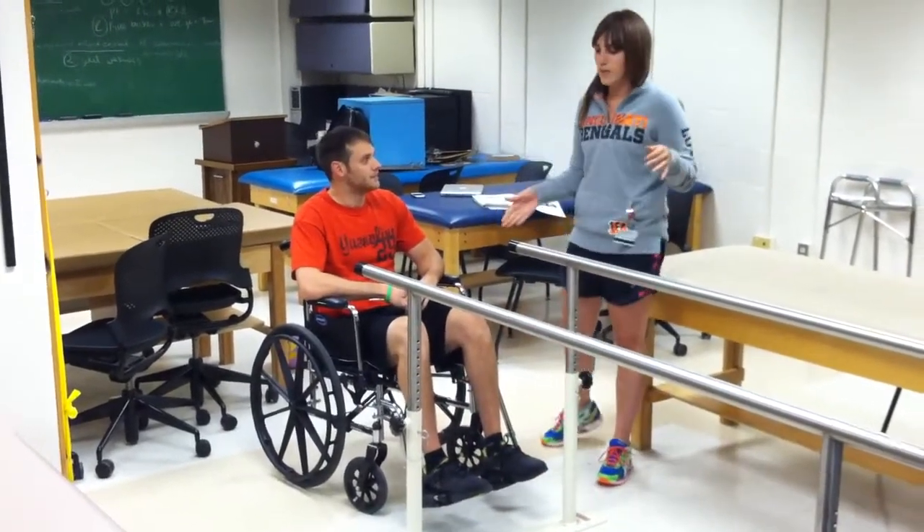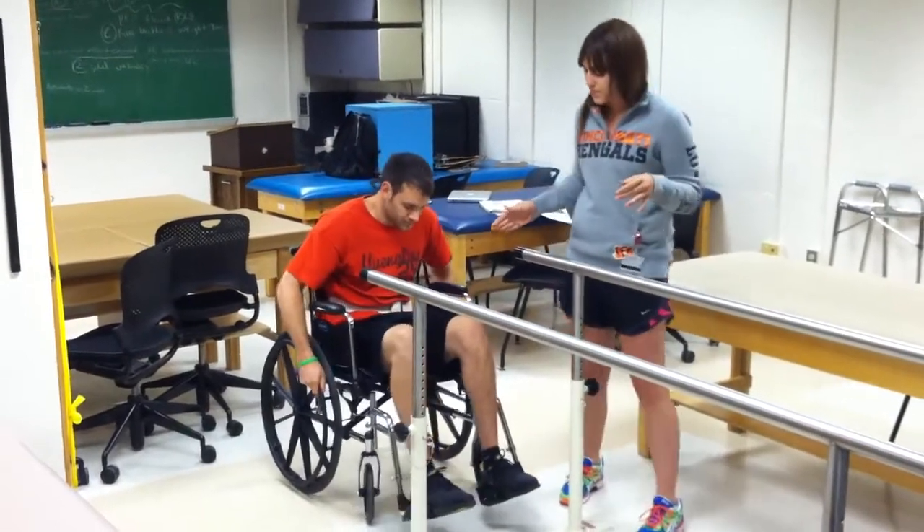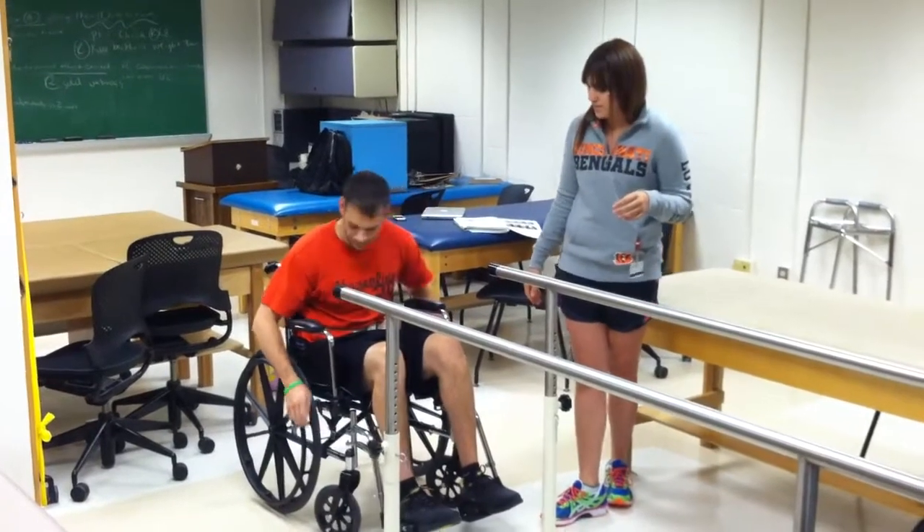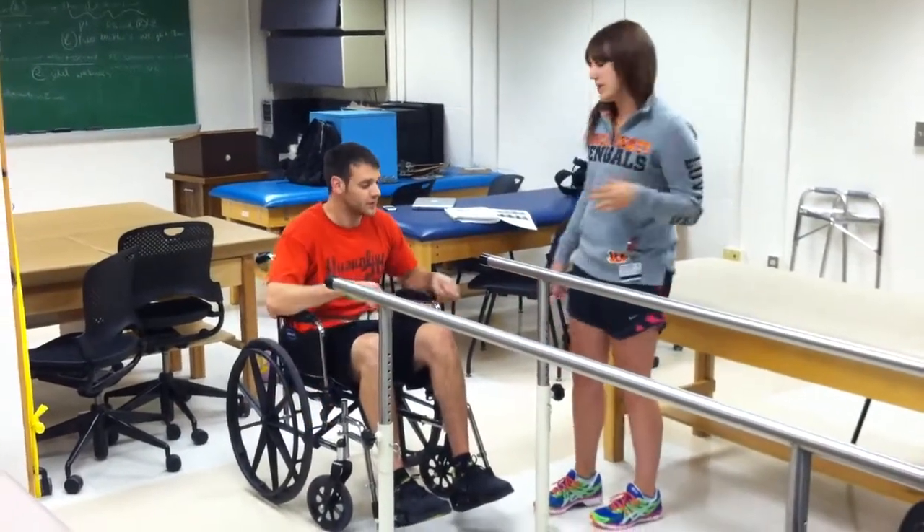So what we're first going to do is have Dave wheel up to the parallel bars, lock his wheelchair, and then we're going to swing his footrest out.